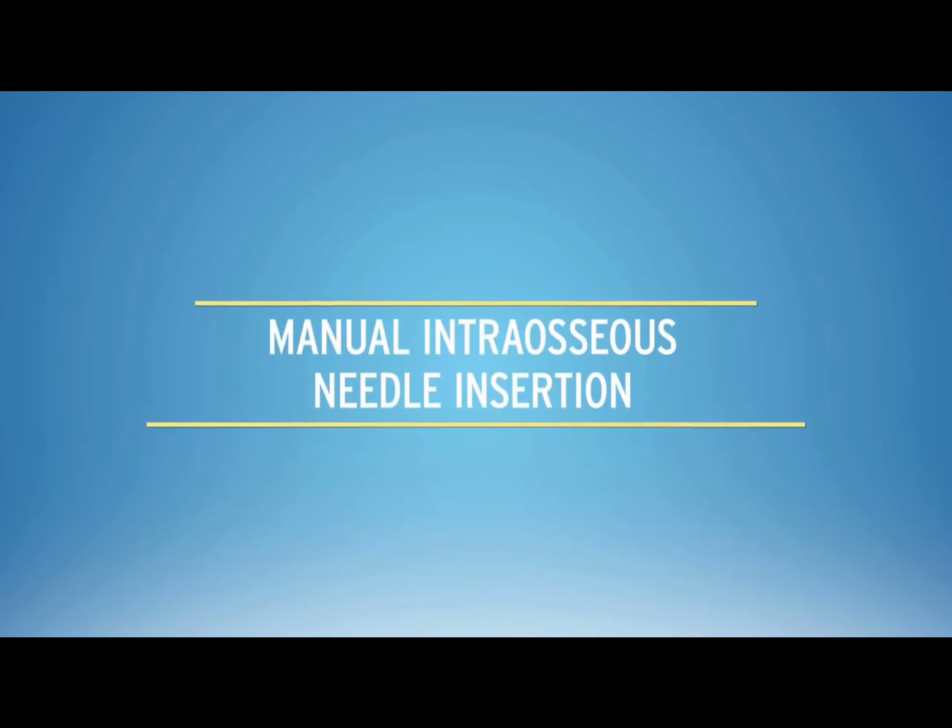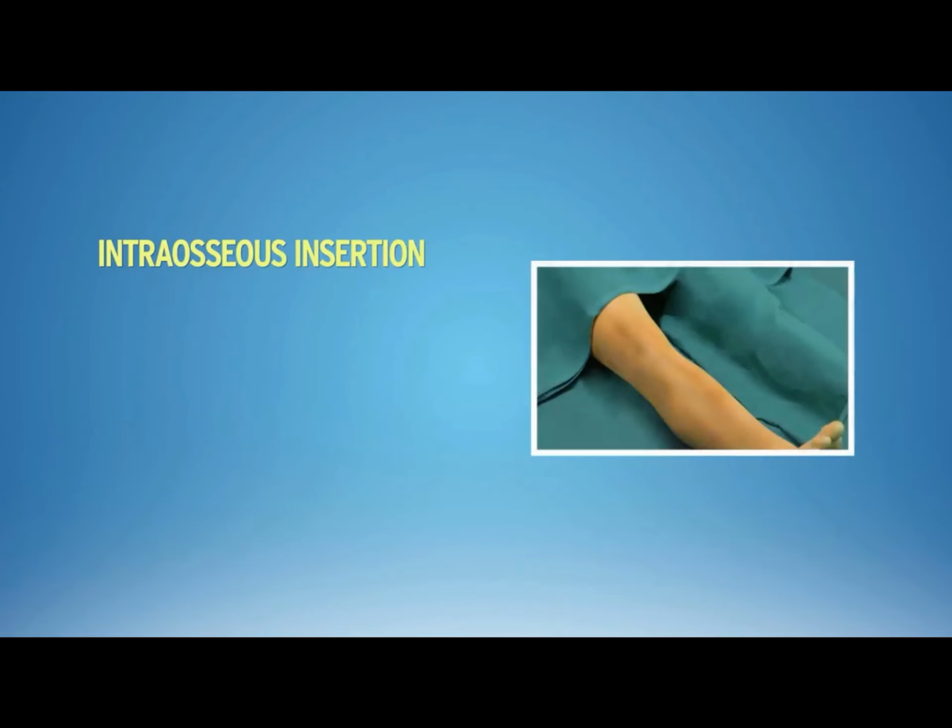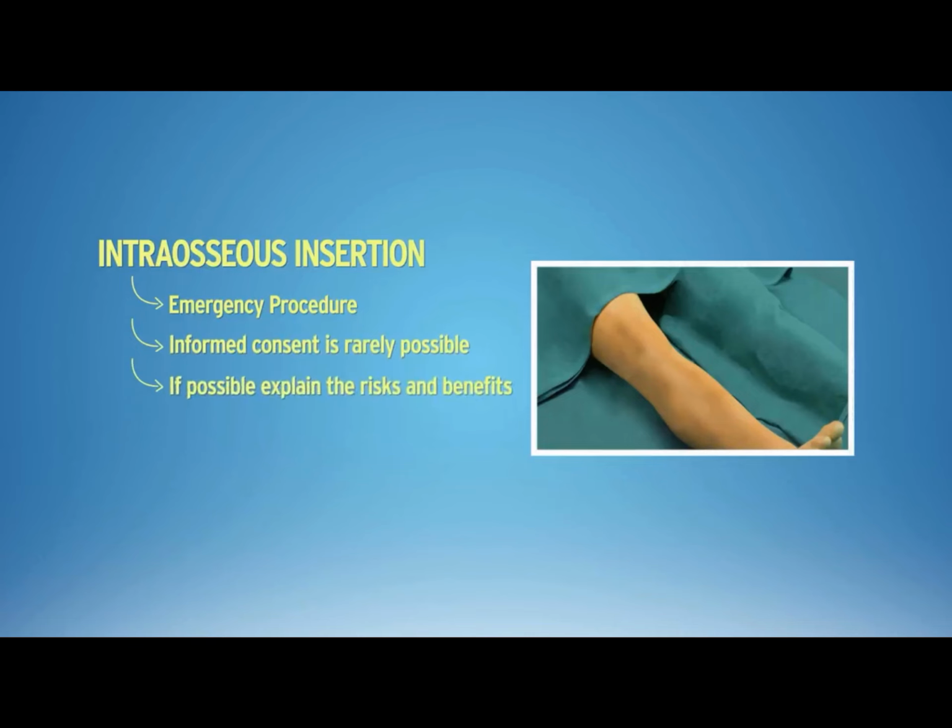Inserting intraosseous needle manually. Accessing the intraosseous cavity is an emergency procedure. Hence, it is rarely possible to obtain informed consent before performing the procedure. If possible, explain the risks and benefits of the procedure to the patient or the next of kin. Otherwise, proceed with the insertion.